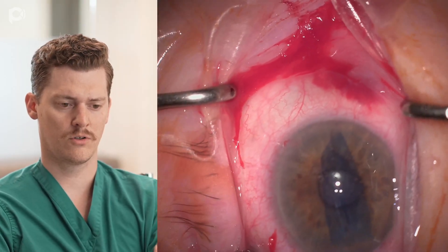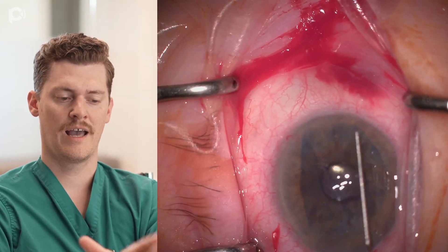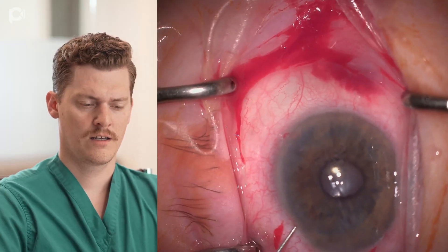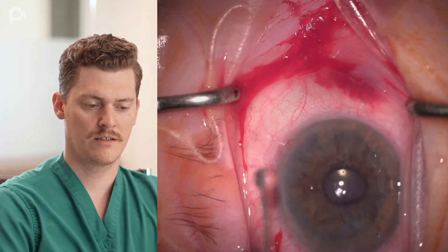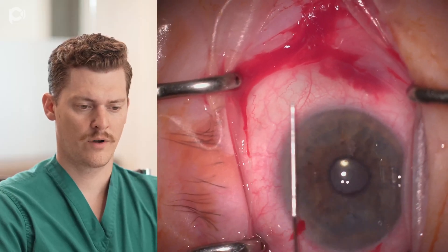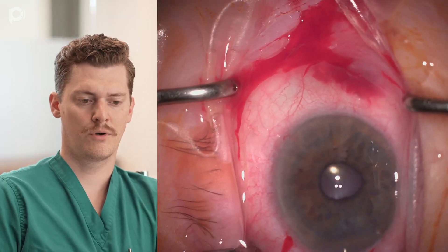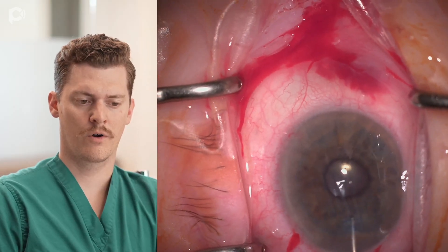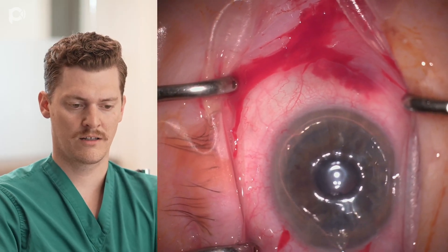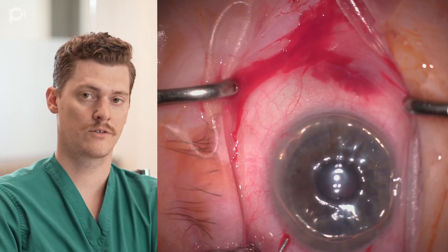I'm going to try to push the graft up into the angle to see if I can figure out what orientation the graft is in. After pushing it towards the angle a little bit, I see it form a double scroll, and to me it looks like it's in a right-side-up orientation. So I'm going to grab the cannula and hit parallel right on top of the graft as it unfolds. We can see that it's right-side-up based on the orientation mark on the top of the eye. The graft is a little decentered, so I deepen the chamber and shuffle the graft over so that it's in a better position. After making sure all the edges are unfolded, I go in with the air cannula and put air underneath the graft. Since this is a fairly shallow eye, I can put air in peripherally without worrying about moving the graft. I slide the cannula underneath the graft and inject air, raising the graft up against the back of the cornea. I move over to the paracentesis to be able to raise the graft completely and complete the surgery.